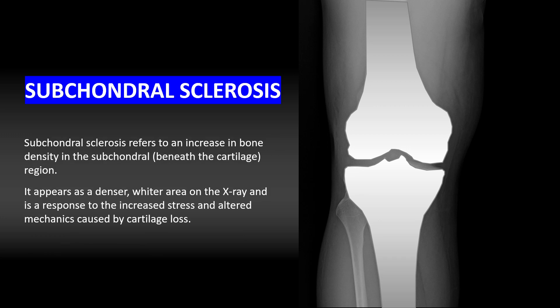Subchondral sclerosis refers to an increase in bone density in the subchondral region of the bone, which is beneath the cartilage. It appears as a denser, whiter area on the x-ray — these white lines on the edges of the articular surface. This is a response to the increased stress and altered mechanics caused by cartilage loss.